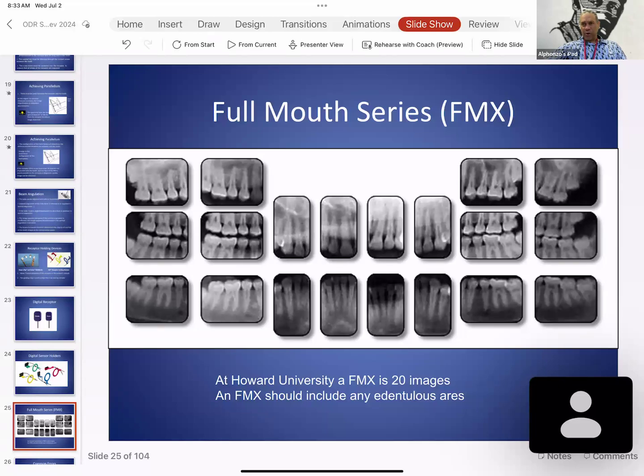But if there's a great deal of edentulous area, there are other forms of radiograph we can use, and pan is the image of choice in that regard. When there are just a few teeth, we'll take selected PAs and take a pan.